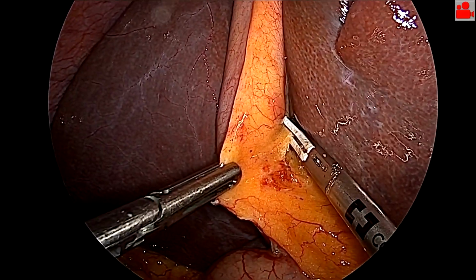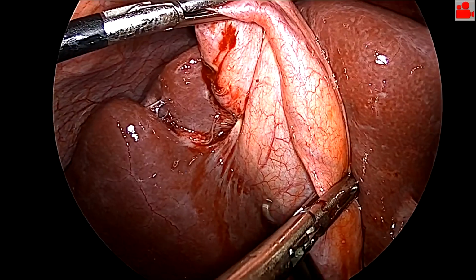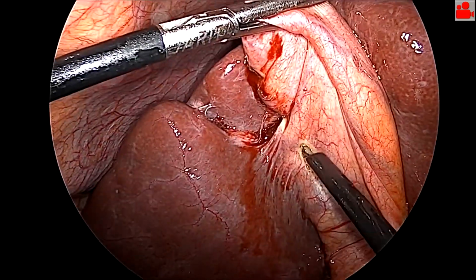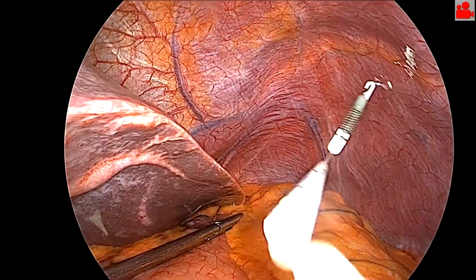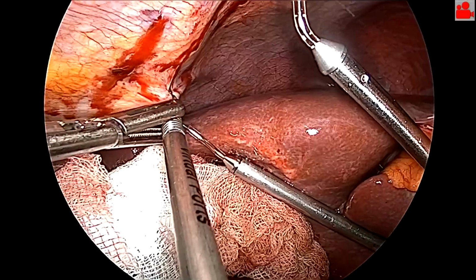We actually start the surgery with a gallbladder excision in a retrograde manner. Here we can see that there were no mentioned difficulties to manipulate it. A dissection within the peritoneum awaited complete mobilization of the gallbladder. Then we insert a retractor in order to improve exposure in the area of the hepaticoduodenal ligament.